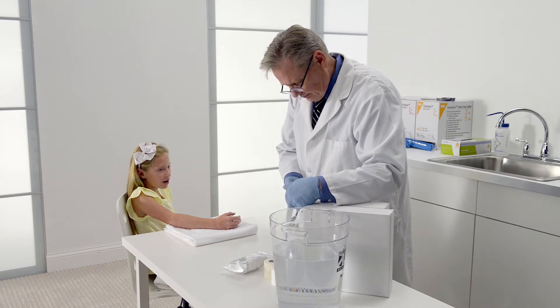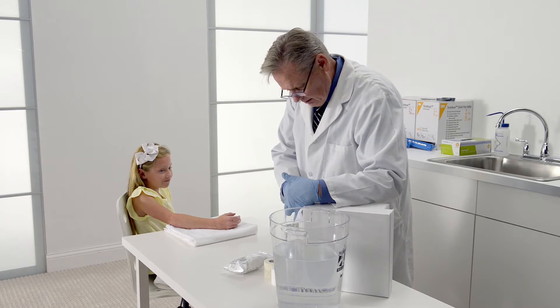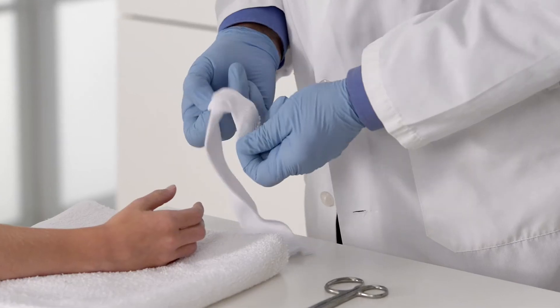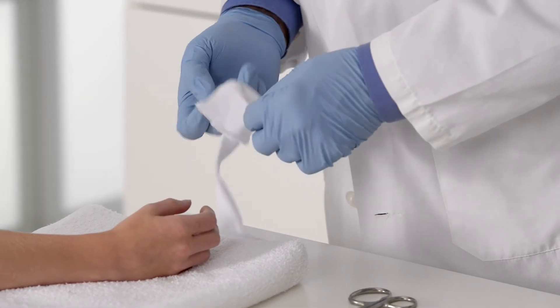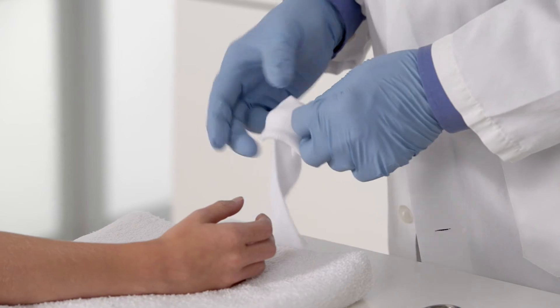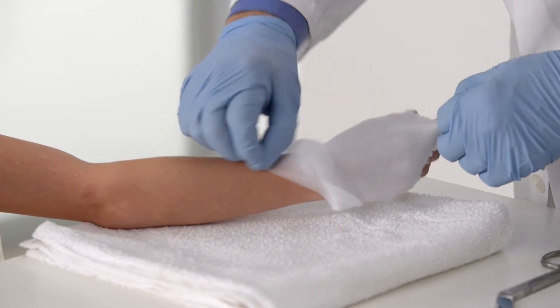First, cut the 3M synthetic cast stockinette long enough to extend from the patient's fingertips to just above the elbow. Remember the stockinette becomes shorter as it widens in diameter. Roll the stockinette into a donut shape for easy application. Beginning at the fingertips, unroll the stockinette over the extremity.